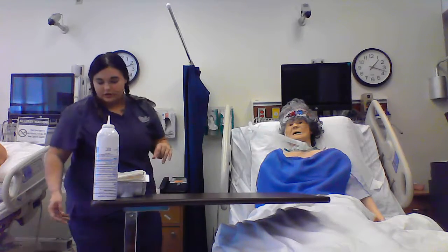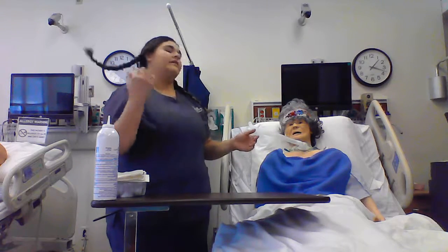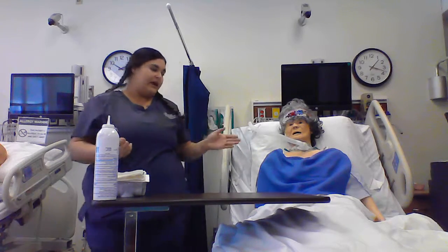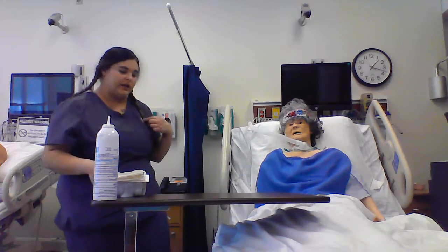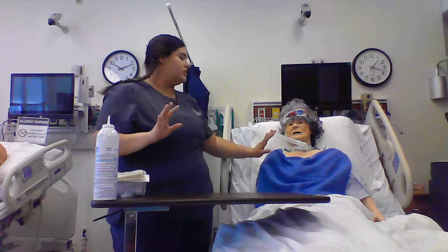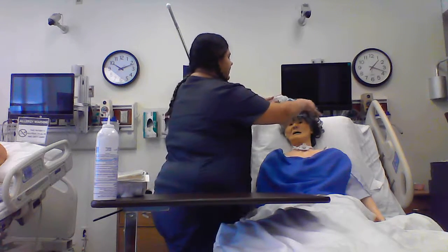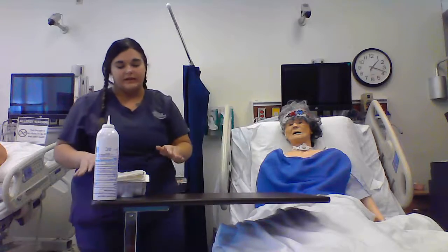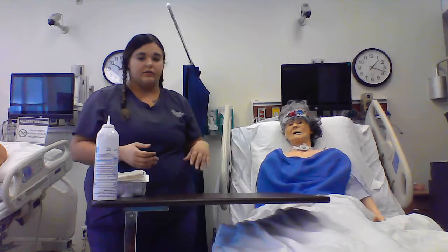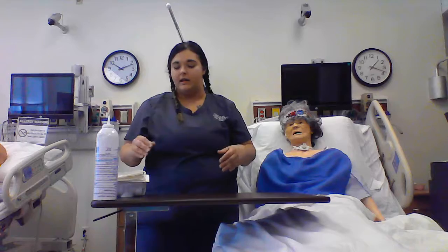I would also want to make sure that I reassess my patient. Her lungs are more clear now. She's having a lot easier time breathing. So I know that I am ready to perform her trach care and clean the inner cannula. Her oxygen saturations are okay, and she's feeling okay. So I'm going to take her oxygen mask off here. Then if any time during this my patient desats or is having a difficult time breathing, I can reoxygenate them and then redon new sterile gloves as needed.